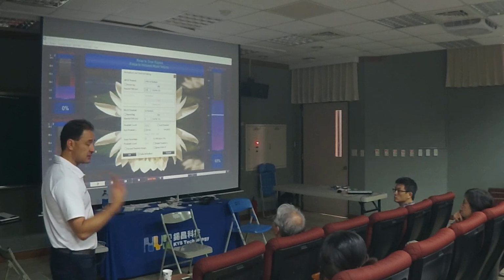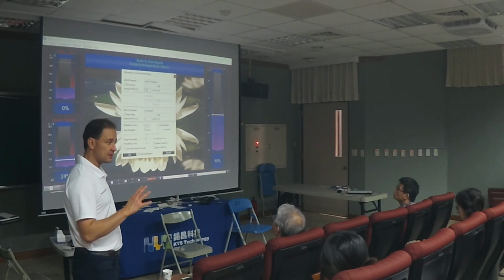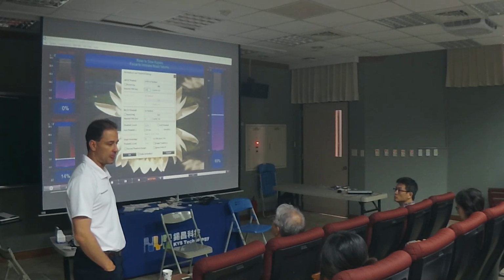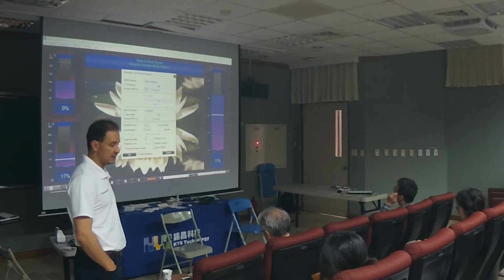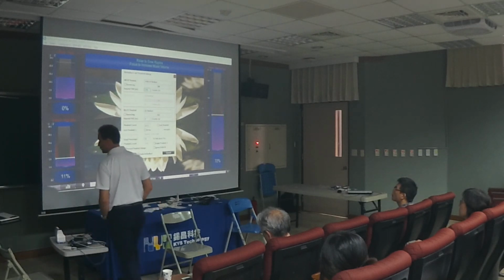0 if the client is very, very skilled. 250, they're mildly skilled, and if they take time, go to 500 for the inhibits. Okay. Now for the reward, so let's say we want to reward SMR.